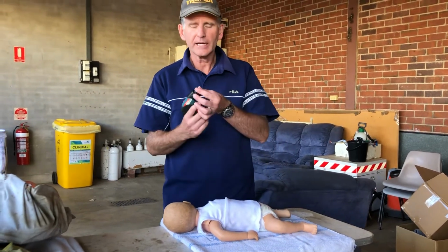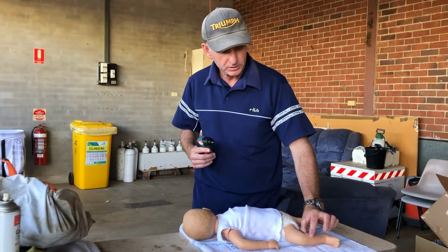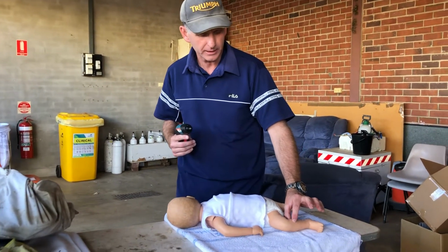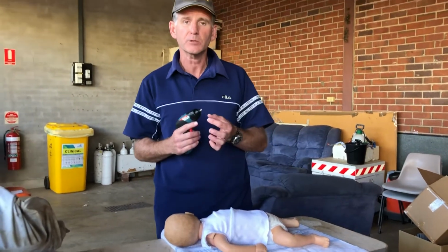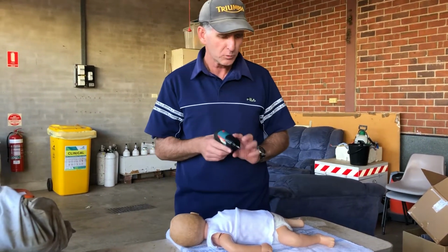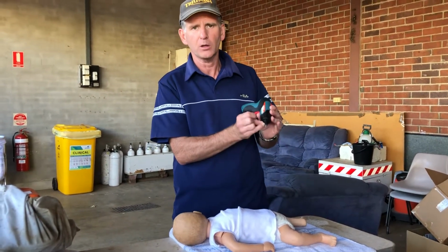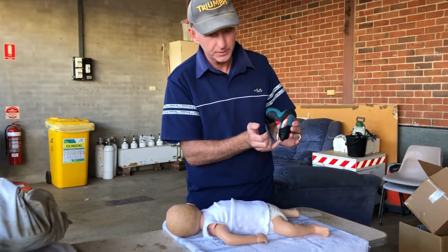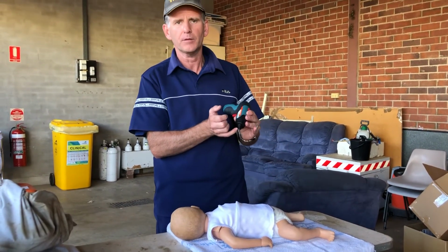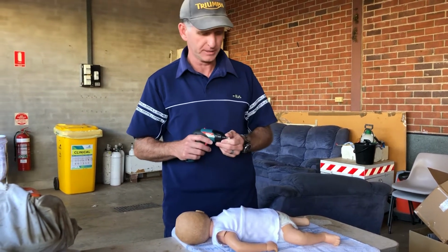We'll get our drill set and our needle set, and using our finger, we'll decide how deep we need to go, how deep that flesh is. After doing so, we'll decide which needle set we need to use, and then we'll make sure that when we put it in, there's 5 millimetres between the skin and the hub of the needle. There's a little black line on the needles, and that'll give the game away.